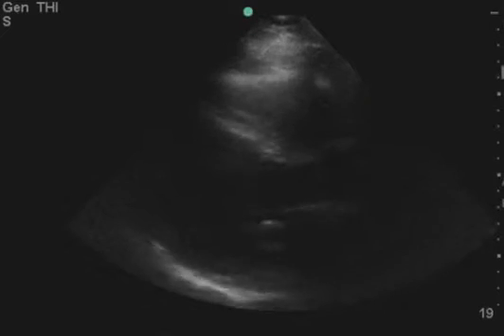This is a patient who came in to be admitted to the hospital for IV antibiotics for pneumonia. Patient had a history of COPD, cough, and the PCP felt based on X-ray that this was a pneumonia and needed to be treated with both IV fluids and antibiotics. The provider does both a cardiac ultrasound and IVC ultrasound, which clinches the diagnosis.